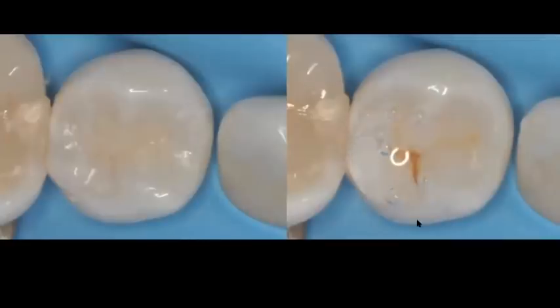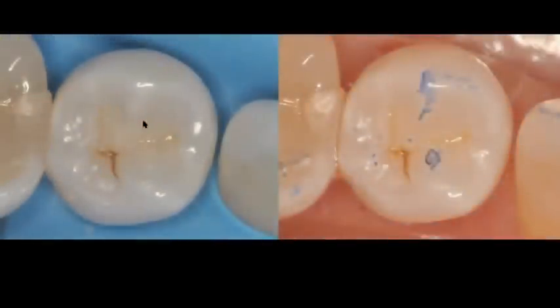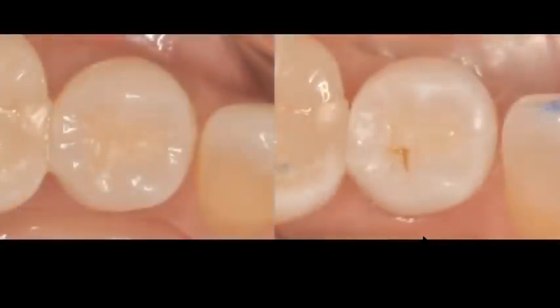I'm using a glycerin layer to do my final curing of this restoration. This will eliminate any oxygen in the area so that it will increase the potential of polymerization of my composite for sure. And then you can see the pit system, the pit and the groove that we were able to stain. And this is now the final occlusal adjustment. We adjust here, we eliminate any of the contacts, and we are done with this restoration. And again, you can see the Y shape that we were able to recreate following the concepts of essential lines. You can see the before and after.